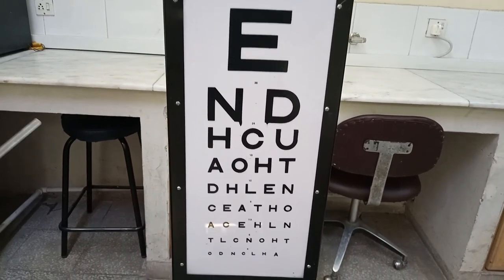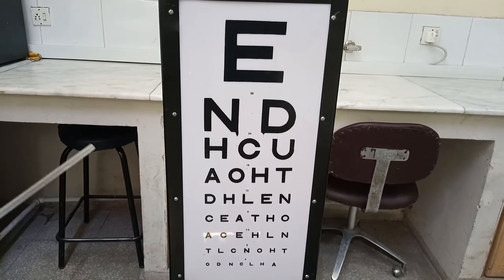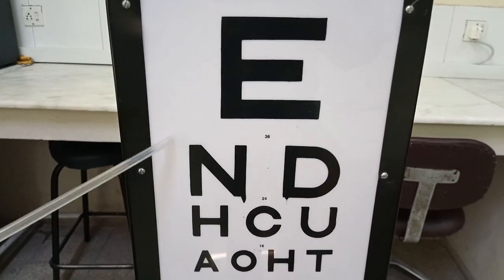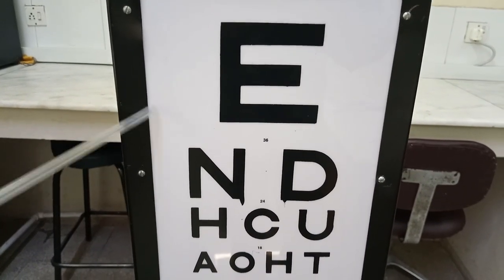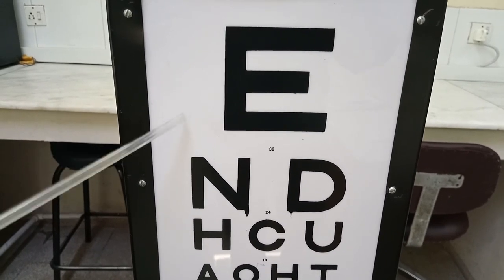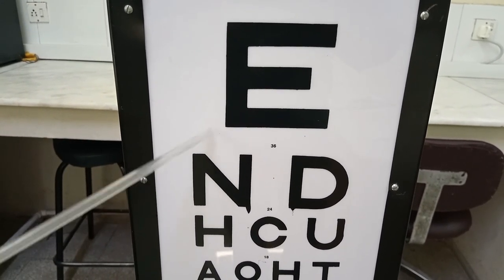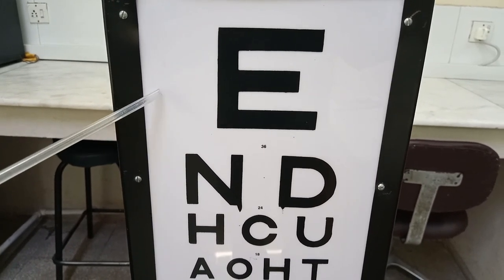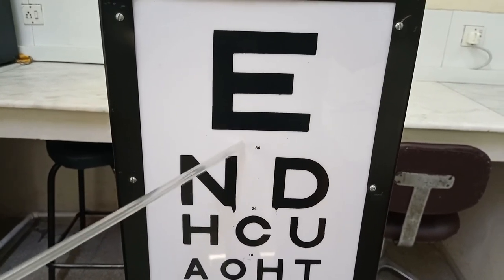Different Snellen's charts have different sizes of letters. So in some, you will find the number 60 and the size is very big. If there is 60, it means that the line is to be seen normally at a distance of 60 meters. So it's okay if the Snellen chart is different. What's important is you note down the number.